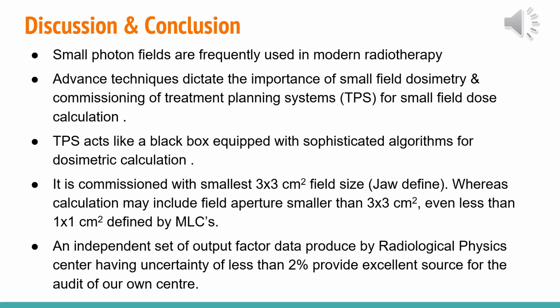An independent set of output factor data produced by Radiological Physics Center has uncertainty of less than 2% provide excellent source for audit of our own center.